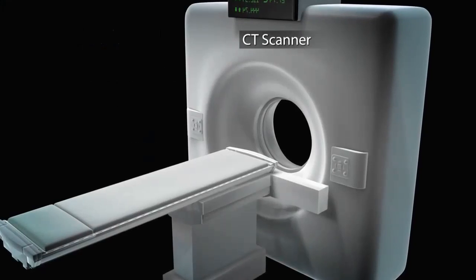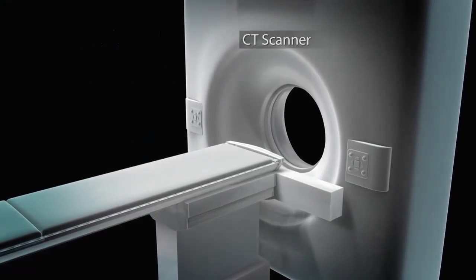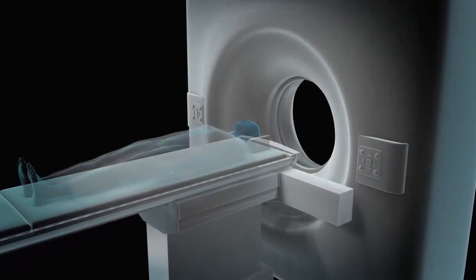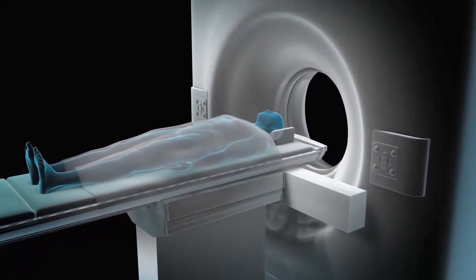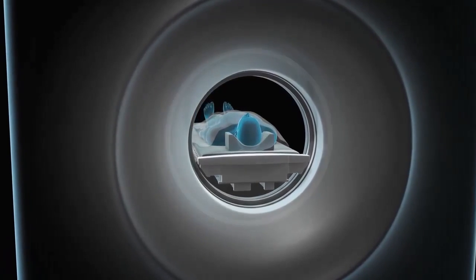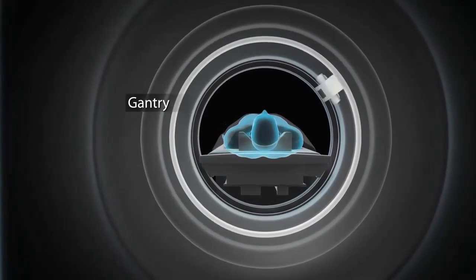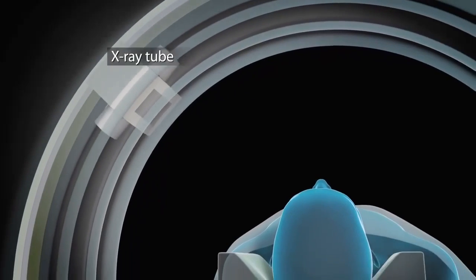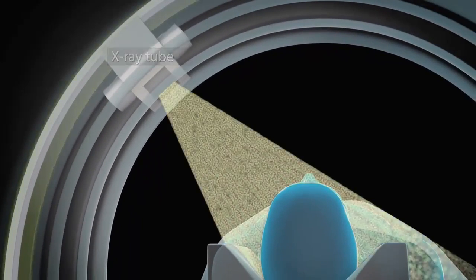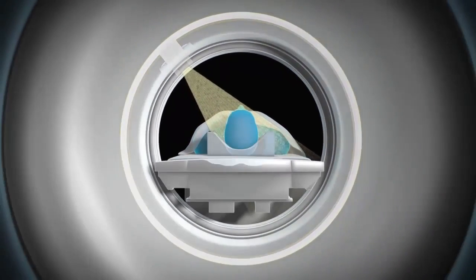A CT scanner is a large square or round X-ray machine with a tunnel through the center. During your CT scan, you will lie on a table that slowly passes through the tunnel. As you move through the tunnel, a giant ring called a gantry will rotate around your body. The gantry contains a tube that will release X-ray beams and detectors that will measure the amount of radiation absorbed by your body.